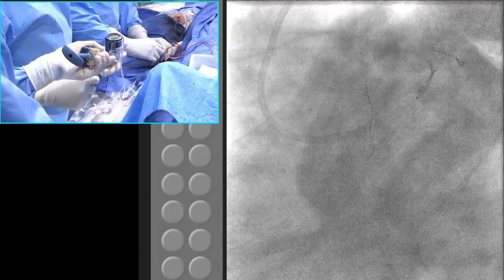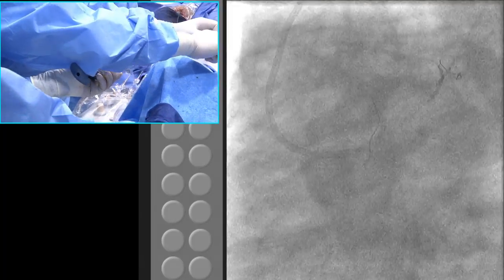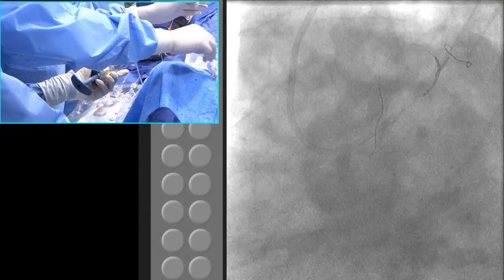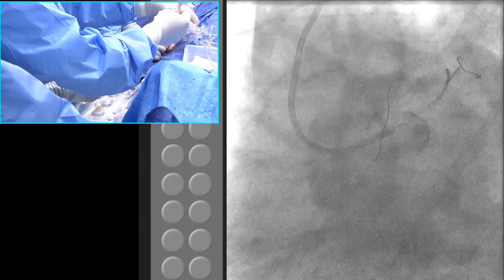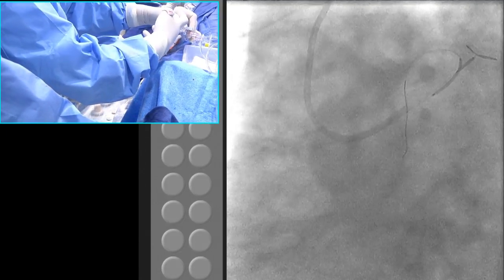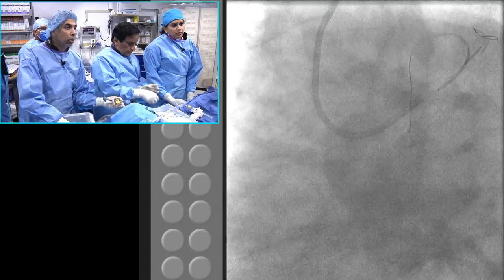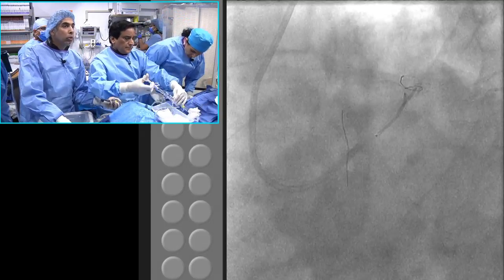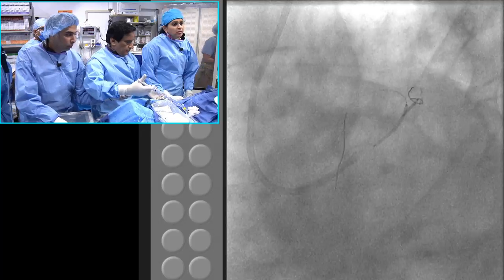Okay, just pull back, you're too far. Okay, hands down. Okay, sure. Some dye. Now the diag stent is sticking out too much. We should have probably got the flow of the LAD. There it is, good. Yeah, with a balloon in the LAD. Okay. Advance LAD a little bit, yeah. Where's LAD? This one? Is LAD. Yeah.